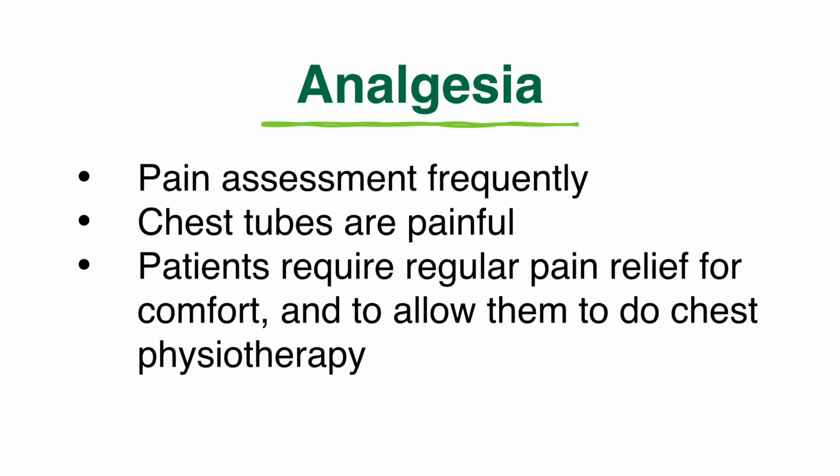Pain assessment should be conducted frequently because chest tubes are very painful, as the parietal pleura is very sensitive. Therefore, the patients require regular pain relief for comfort and to allow them to complete chest physiotherapy or mobilisation.